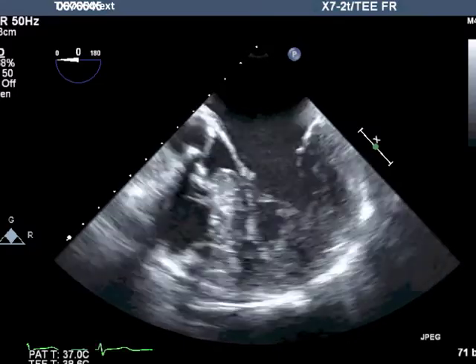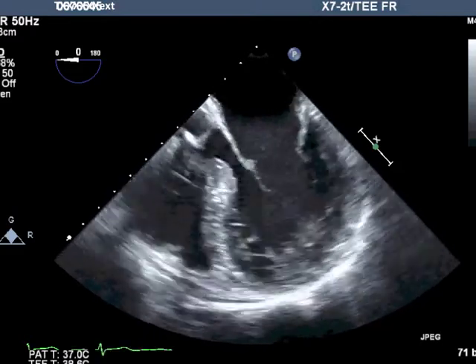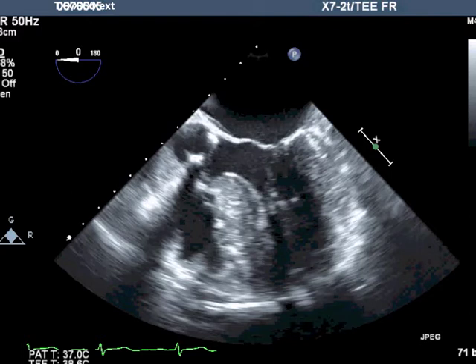This image shows a moving four-chamber view with a little LVOT and aortic valve in it. I want you to focus on the motion of the mitral annulus. During systole it descends, and during diastole it recoils upward. Apex again during systole is stationary.